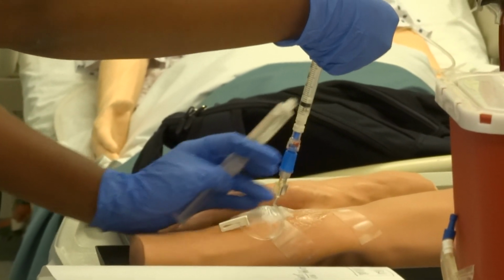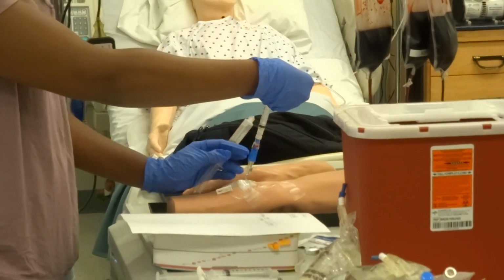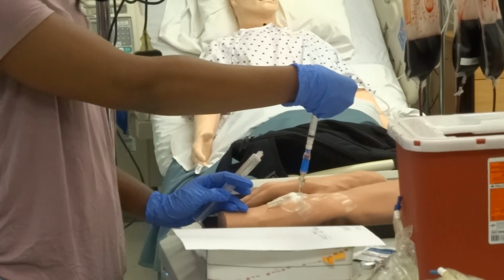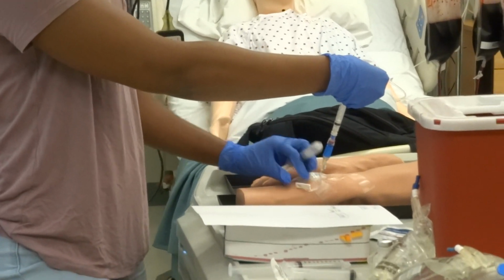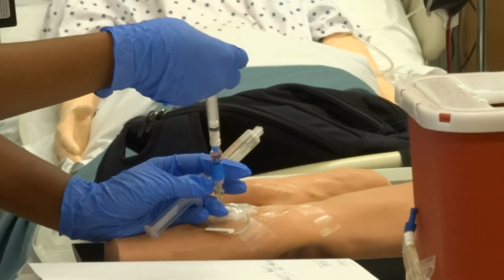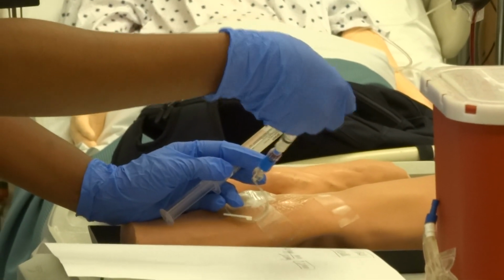So, 2 minutes is up, but did my medication really go in? I made one mistake. What was it? You don't know? The clamp. It's clamped. Uh-oh. That's a rookie mistake. I don't even think it's going to go anywhere. Where is it just going to be then? It's just sitting there, like, what's in the IV.